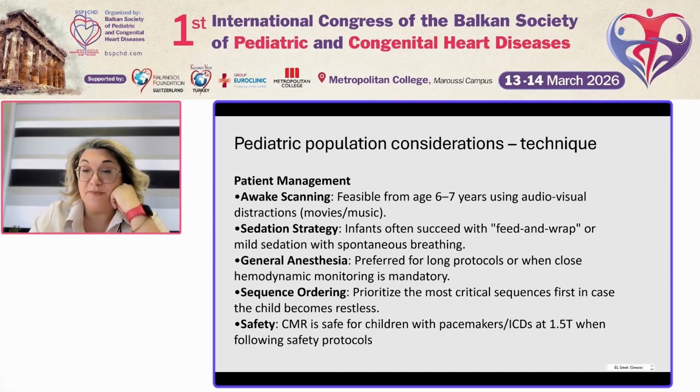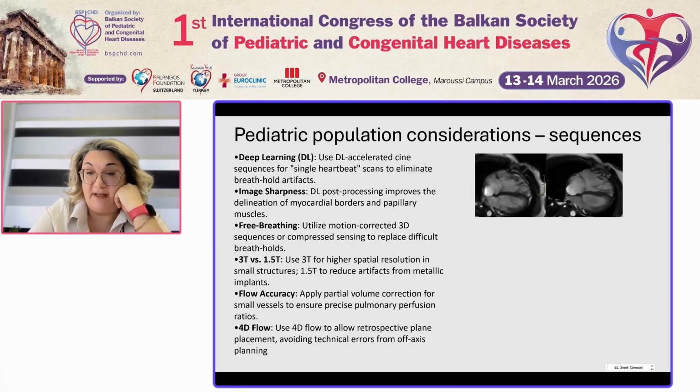It has also been shown that when performed with precautions, it is safe to perform CMR in children with pacemakers and ICDs at 1.5 Tesla, following established safety protocols. Also, there are several technical adaptations that need to be made. Deep learning accelerated cine techniques and free-breathing techniques need to be implemented. Here we demonstrate the improvement in border definition achieved with deep learning reconstruction.